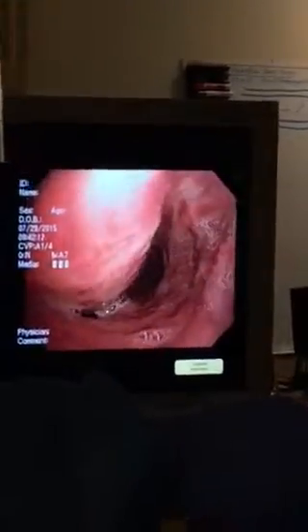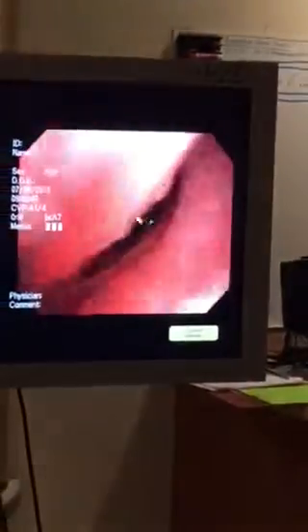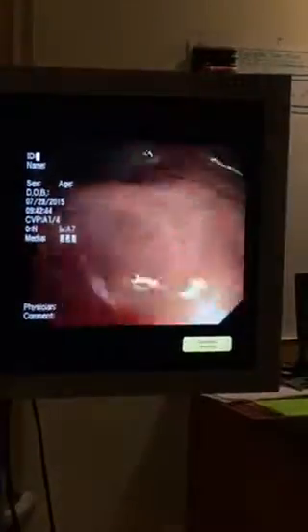Ideally, when you put all that lidocaine on the cords, it keeps them from having that kind of spasm, but you can paralyze it very quickly. Okay, lidocaine on the left. You see the degree of secretions we had down here. It shouldn't be like that either. It's just copious secretion. So what I'm going to do initially is just clear out these airways.